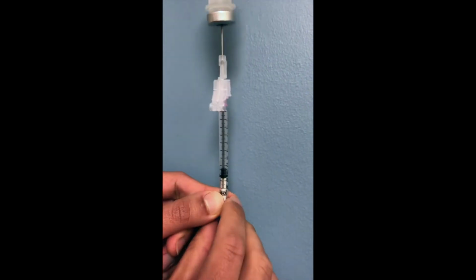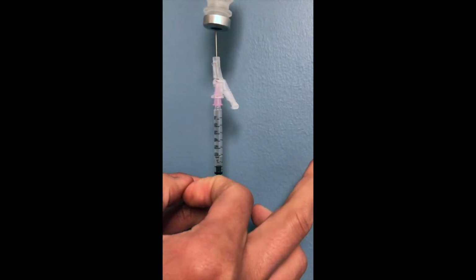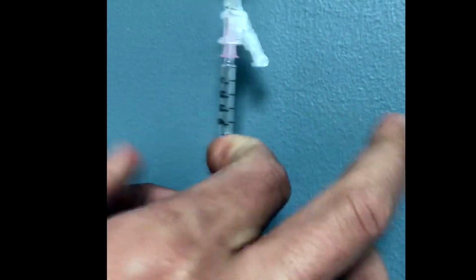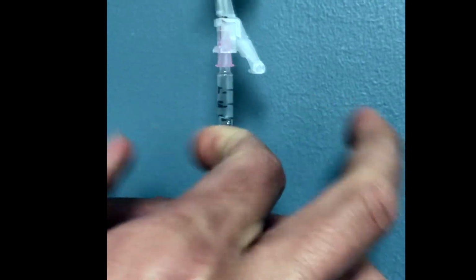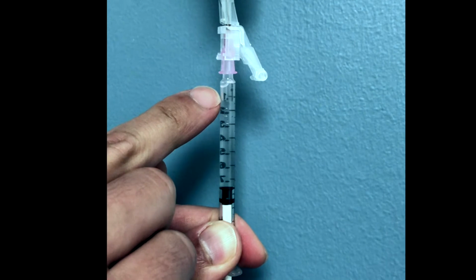That way I can flick this air bubble right here all the way to the top. Sometimes it's a little stubborn, but it'll get there. All right, now my air bubble is all the way up here.